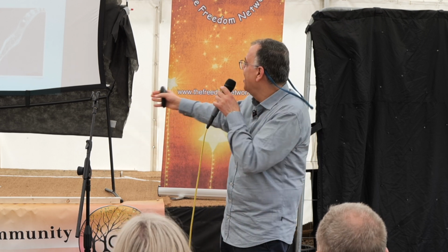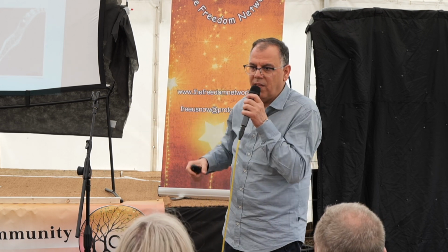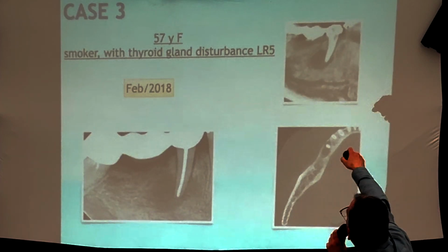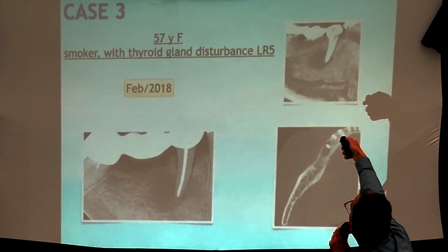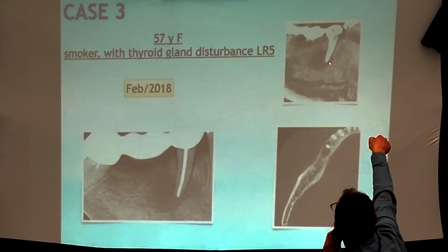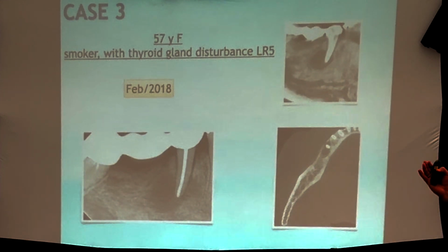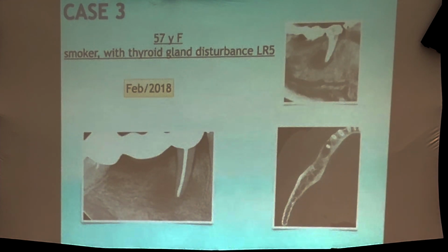She came once, she'd been referred from another colleague. I have the lesion here. Can you see the circle, this dark circle there? Yes, this one, and here another dark circle. This is like a section of a 3D image. So this is a horizontal section, this is a sagittal section, a vertical section, let's say.